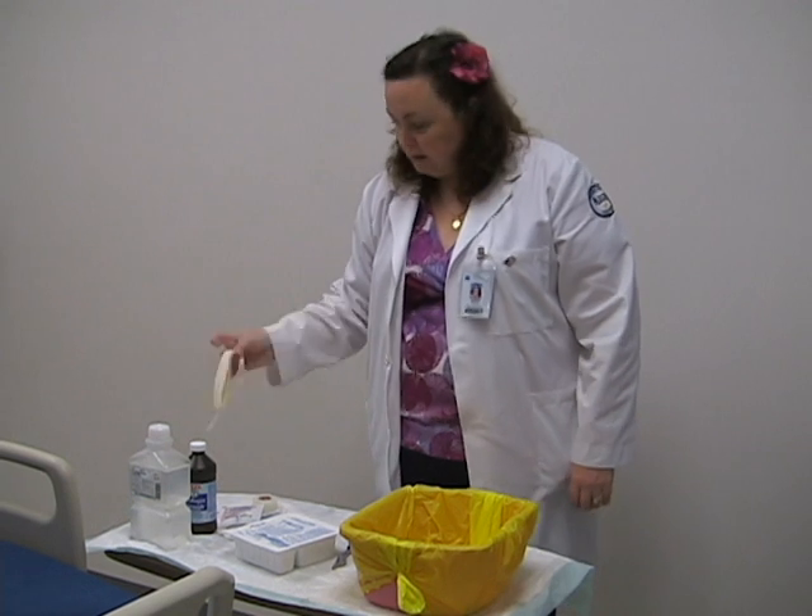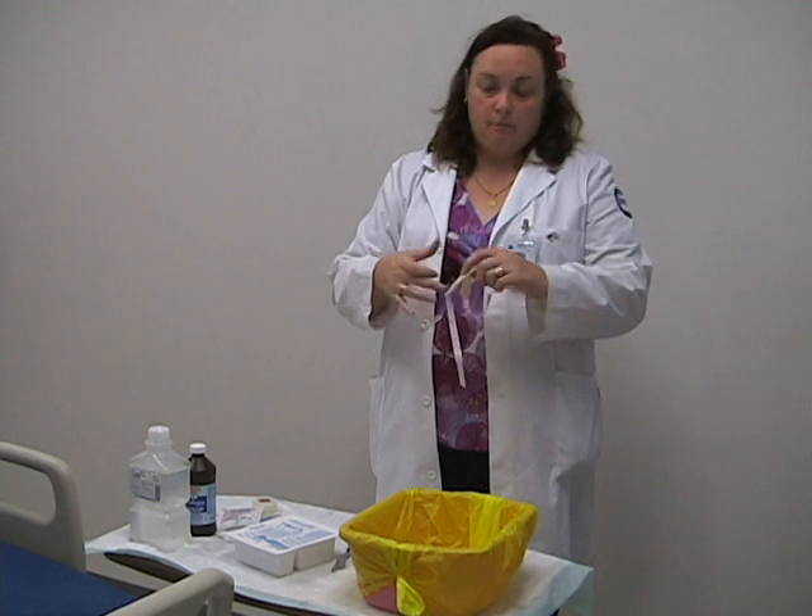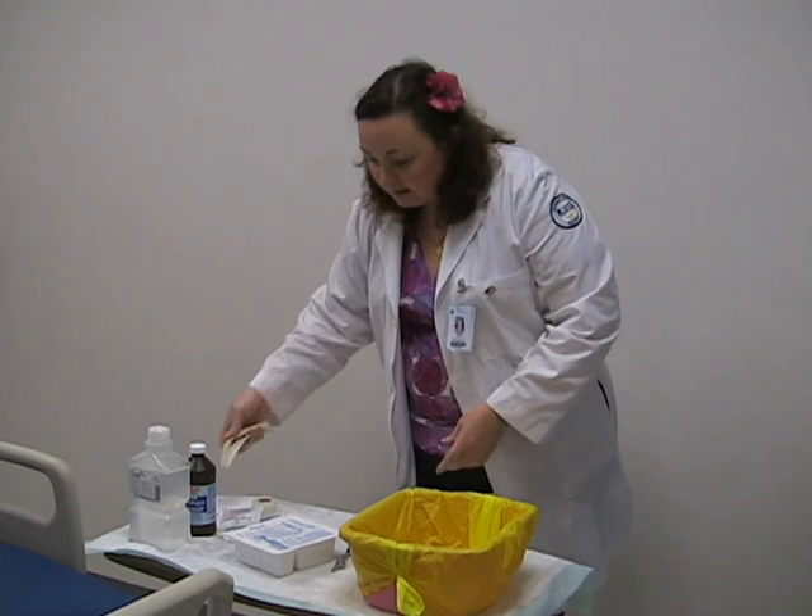Trach ties — these are commercially prepared. You'll see some places where they just have the cotton twill tape where you tie them off. These ones have velcro on the back; I like them because they are a lot easier to reposition. And scissors if necessary.